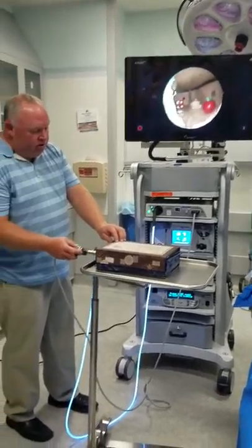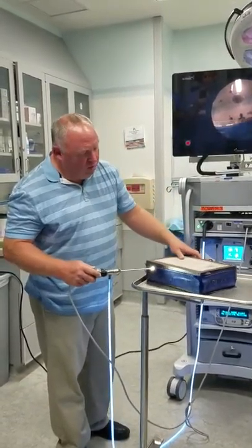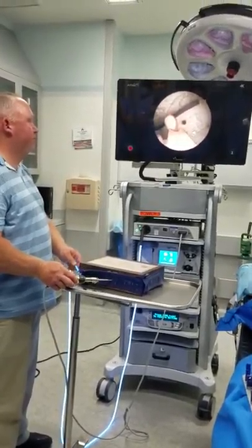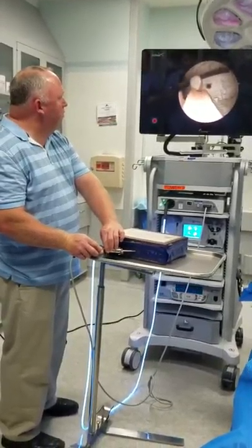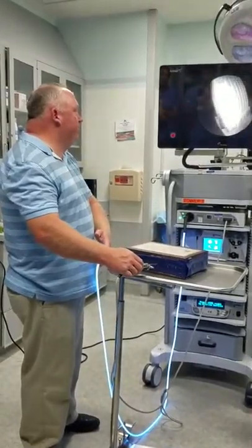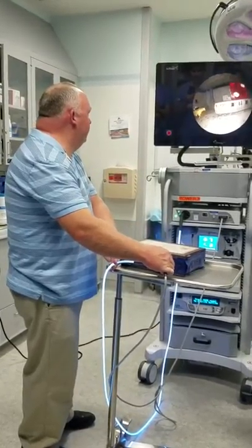And then what we might do is, we see doctors that might do a push on a shoulder, they might go to a different hole, a different portal, to get a different look. If they can't get to the part they want to get to from where they're at, the same view we came out of that hole earlier, over there, and we can focus a little bit here. Right? That's what we were looking at before. We're looking at that hole on the other side. I have dice in here. I have an Empire State shaped building, a trolley car, a taxi, New York things kind of at the bottom here.